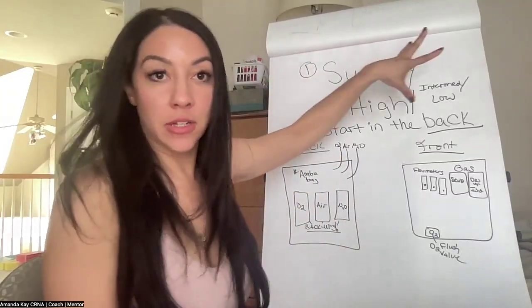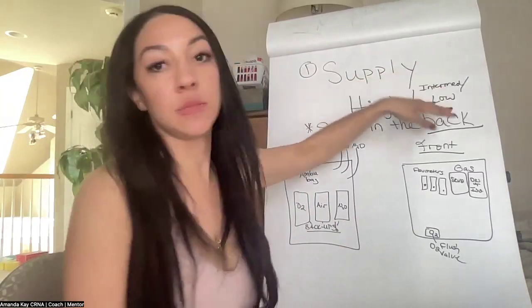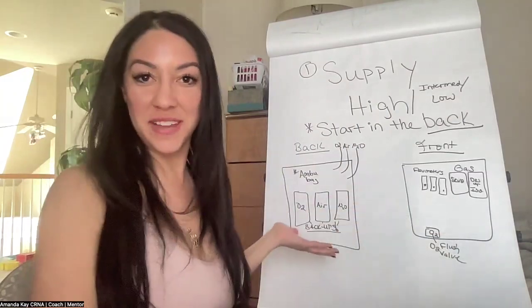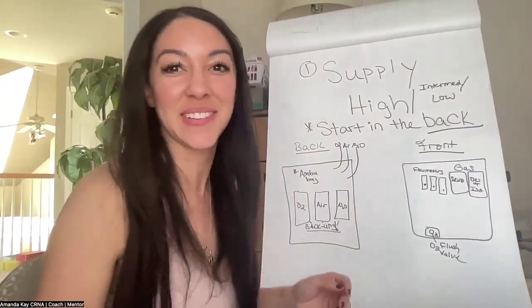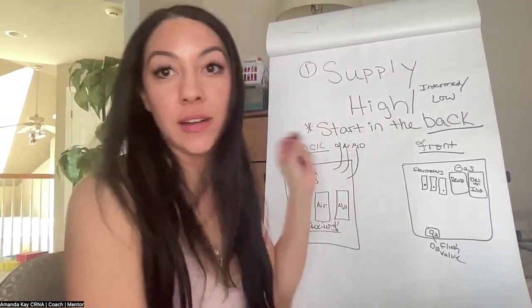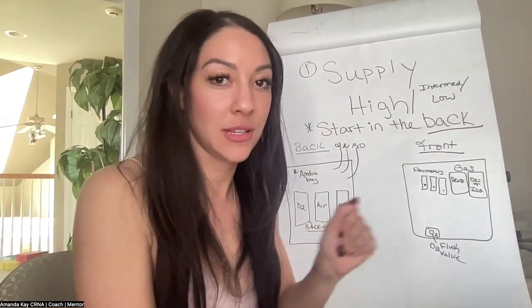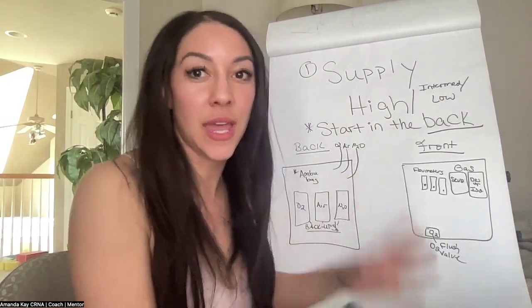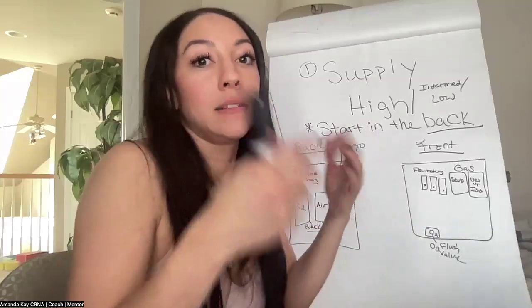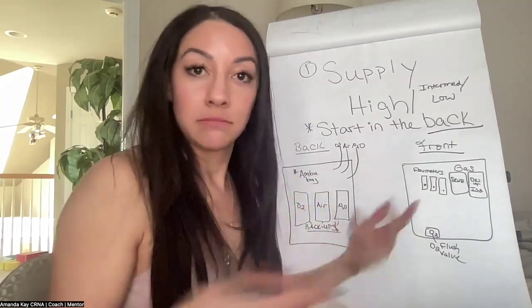First one is supply. We're going to talk about supply. The supply portion uses the high, intermediate, and low pressure systems that I will go over. And I know my pictures are so lovely. Definitely not an artist. So essentially, your machine is supplying oxygen, air, nitrous oxide. Not all places will have all three of those. Every place should have oxygen, because that's crazy otherwise, but they might not have all three. But it's essentially supplying oxygen, air, nitrous oxide, and then the gases to your patients so they can go to sleep for their surgery.